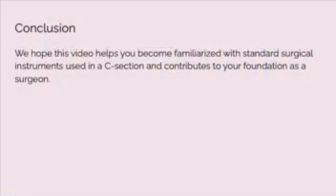We hope this video helps you become familiarized with standard surgical instruments used in the C-section and contributes to your foundation as a surgeon.